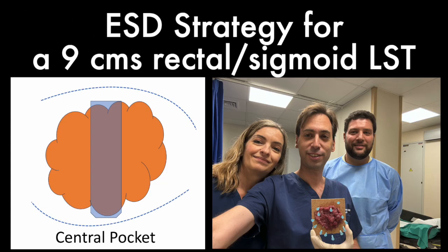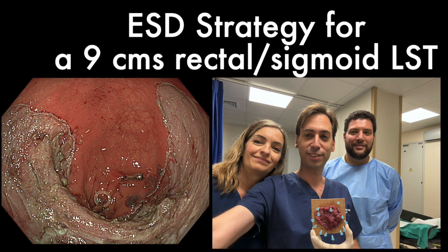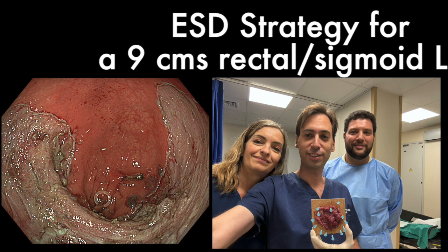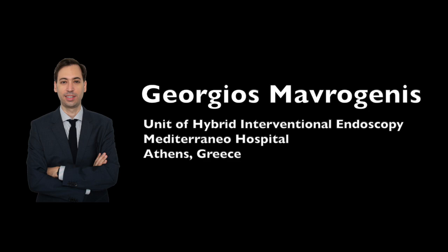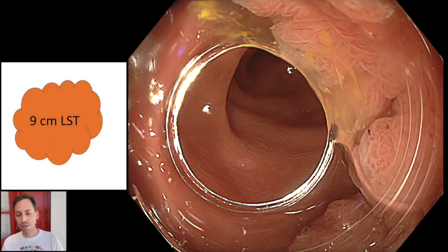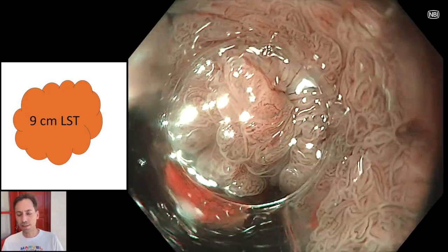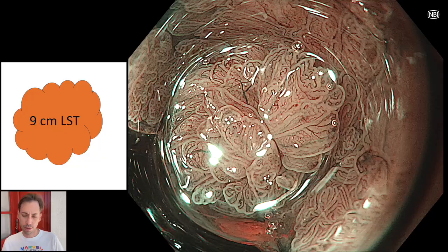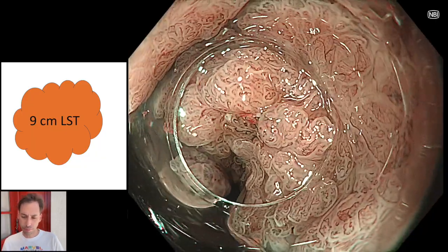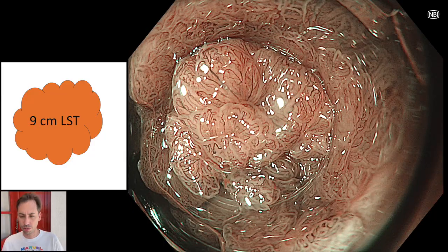Hello, this is a video made to demonstrate the strategy for the resection of a large lesion located at the mid-upper rectum and the distal sigmoid colon. This is a large LST with a JNet 2A and 2B pattern. There are no signs of advanced malignancy of submucosal invasion.